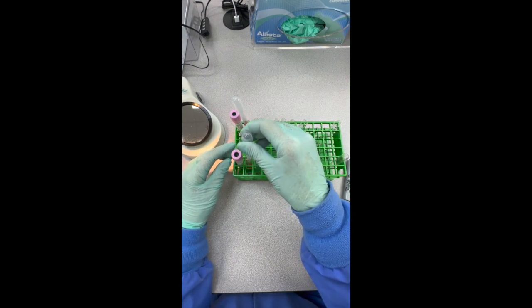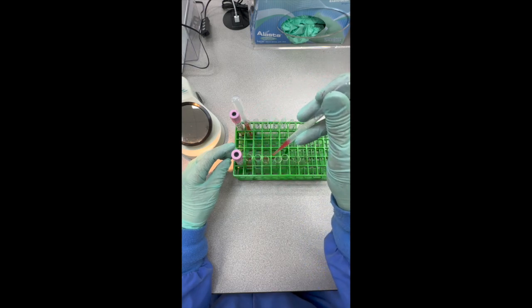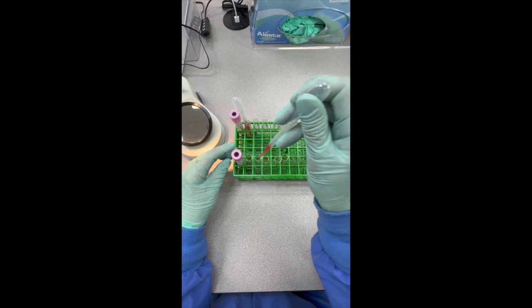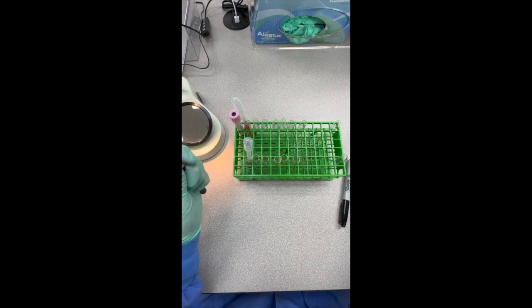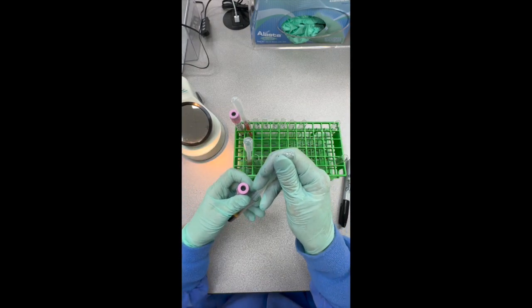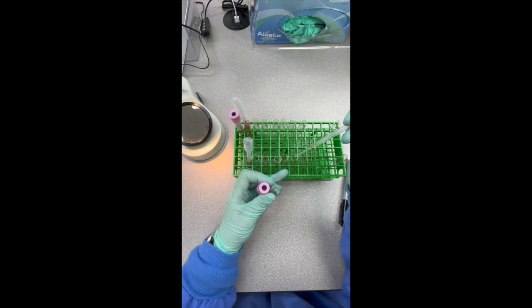So I'm going to take my cell suspension and I'll put one drop into my front type, my A, my B, my D, and my control. Get some plasma here, and we'll put 2 drops into our back type. 2 drops, 1, 2, 1, 2.